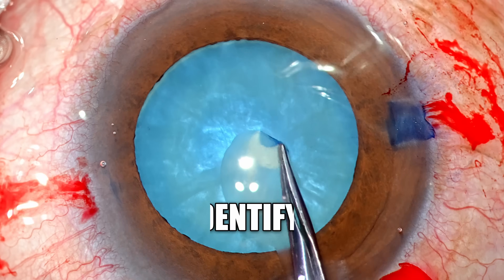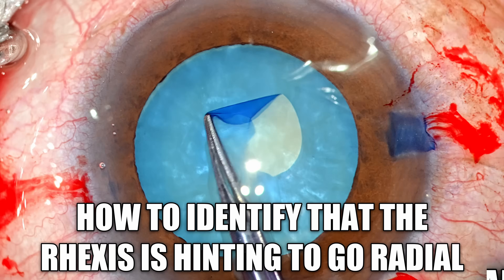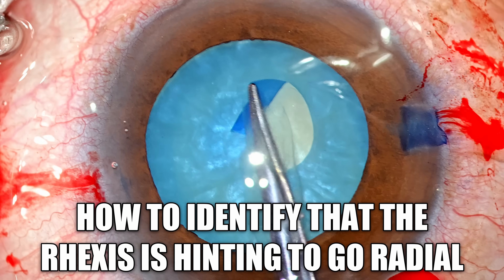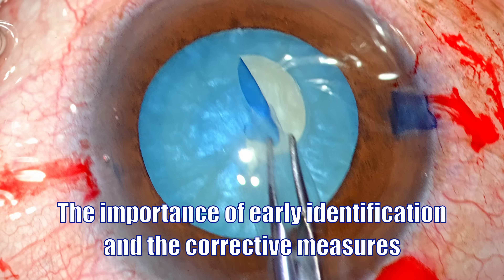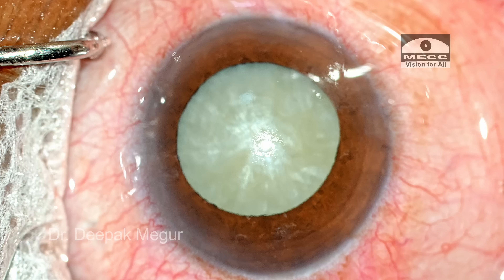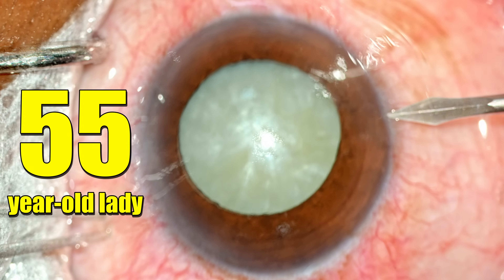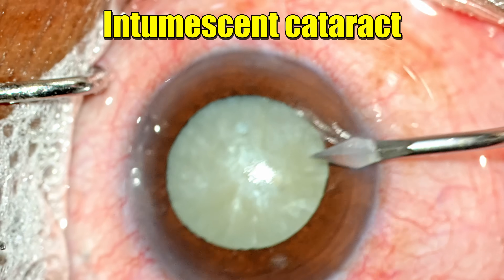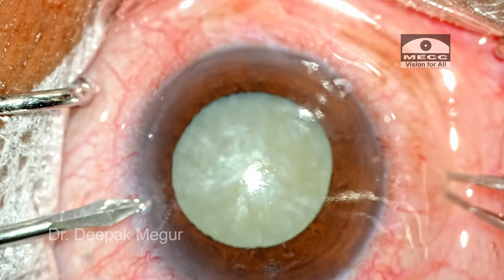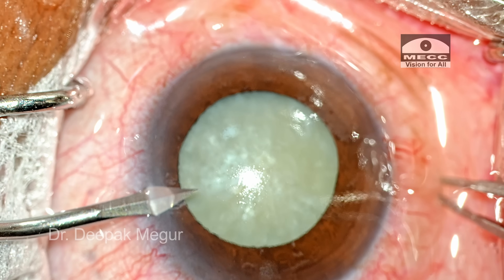In this video we will learn how to identify that the rhexis is intending to go radial, how to identify it early, and how to stop and take corrective measures. I am Dr. Deepak Meghur. Welcome to another interesting case where I will be sharing a few tips. This is a 55-year-old lady who has an intumescent cataract, and we expect that the rhexis could be slightly tricky in this case.